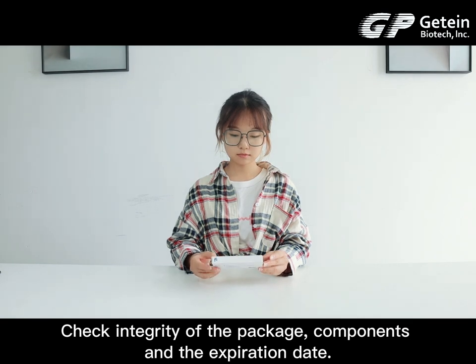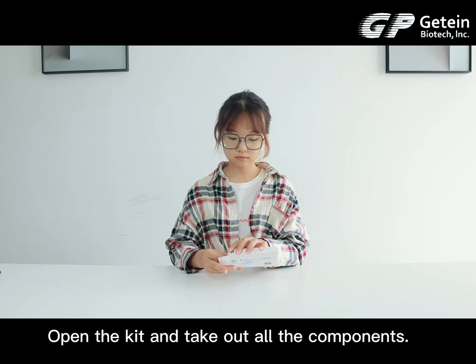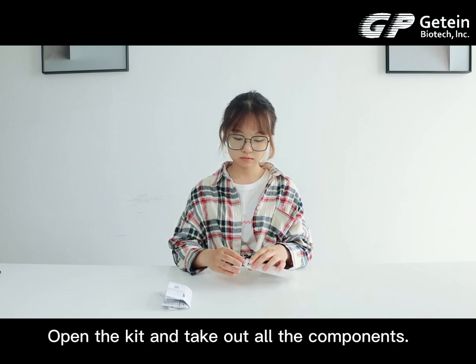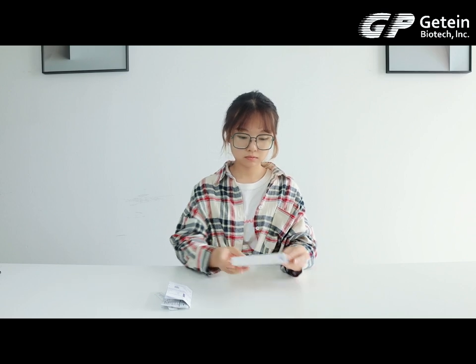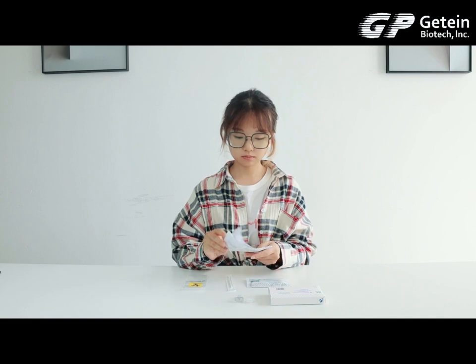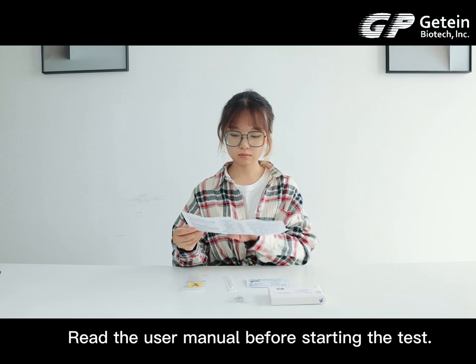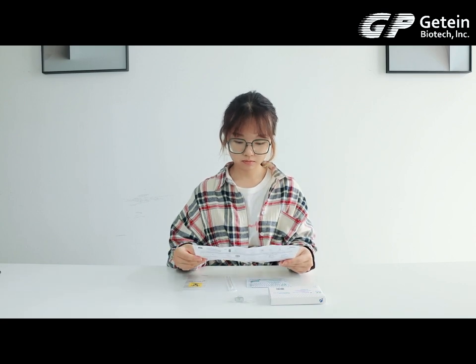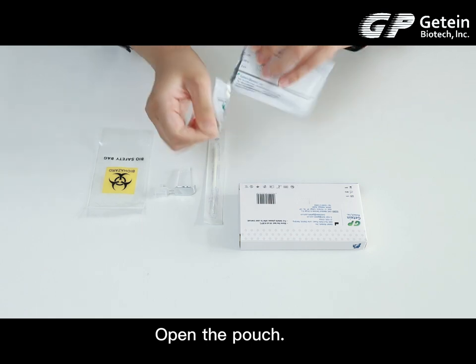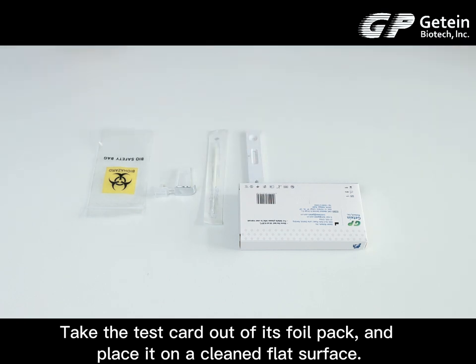Check integrity of the package, components, and expiration date. Open the kit and take out all the components. Read the user manual before starting the test. Open the pouch. Take the test card out of its foil pack and place it on a clean flat surface.